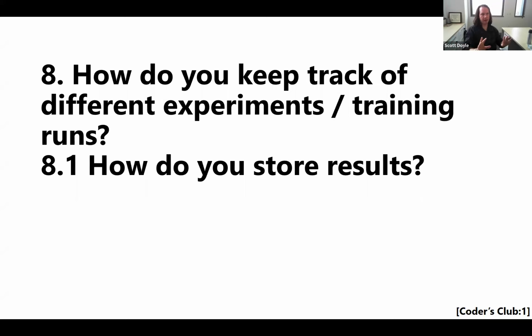Maybe somebody can correct me if these are good for different sort of data parameters, like we're grabbing patches like this, using this policy, using this class set, then that would be great. And I would be happy to revisit that. Exposing every parameter from patch extraction to training parameters to inference and data set stuff, I mean, you're talking about a lot of stuff to record and keep track of. Just naming those and creating the interface for that is a significant amount of work.